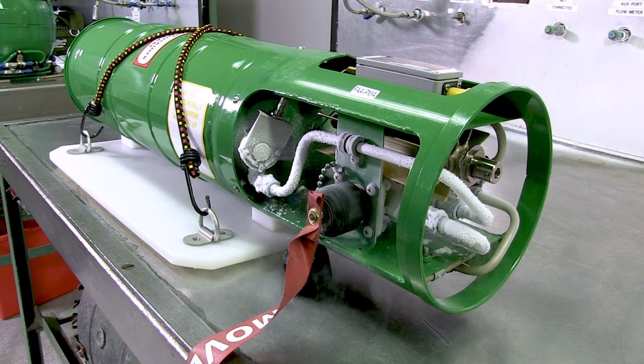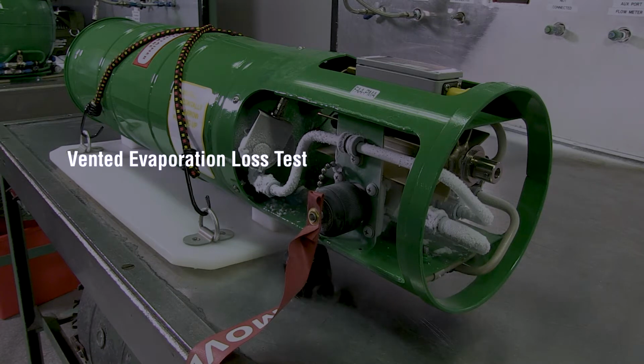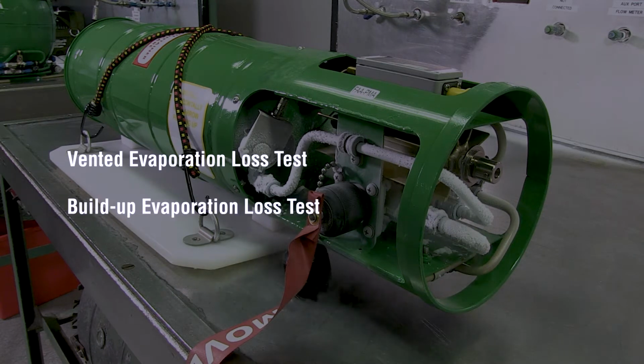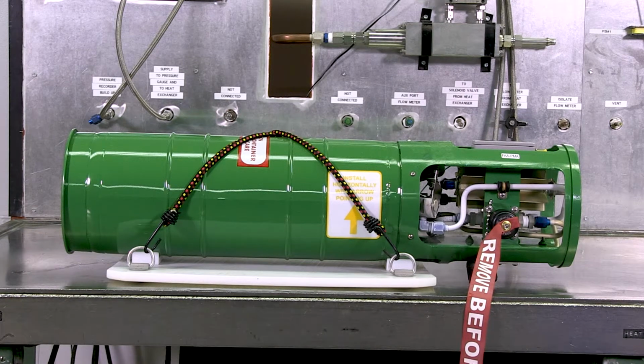If that does not correct the issue, complete a vented evaporation loss test, and if needed, a buildup evaporation loss test, as explained in the manual. If either of these tests are unsuccessful, return the unit to Essex.